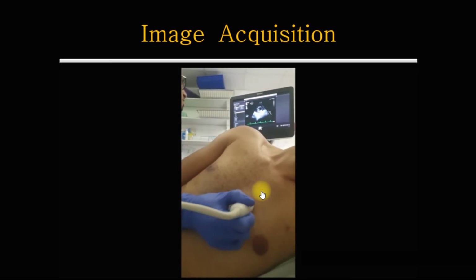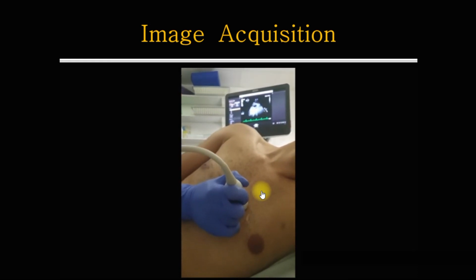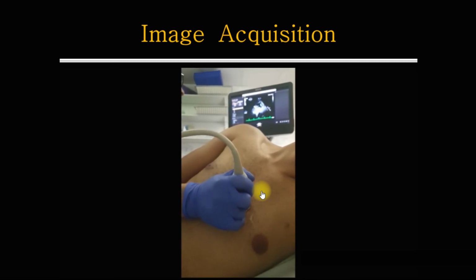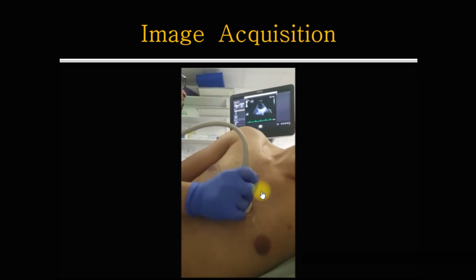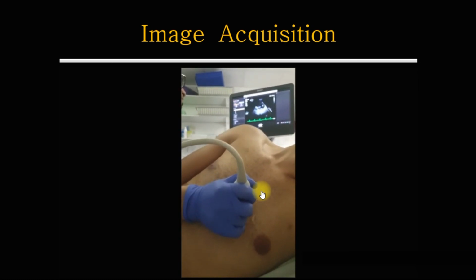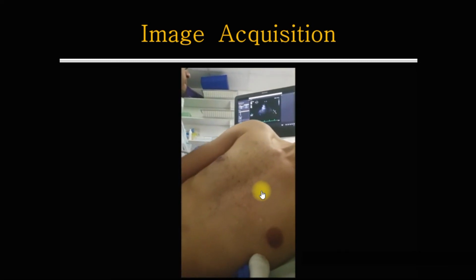rotation toward 12 o'clock to get the parasternal short axis views with further tilting, level of mitral valve, level of papillary muscles, level of left ventricular apex, all with just tilting.